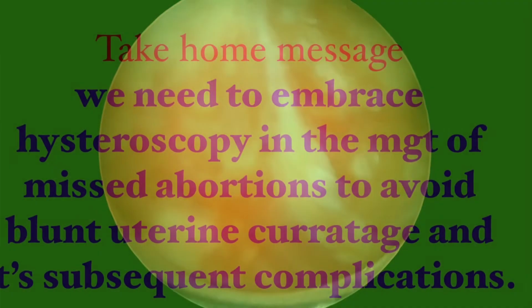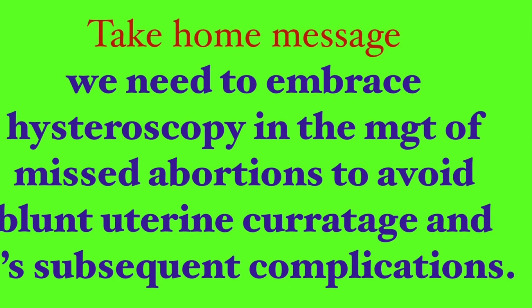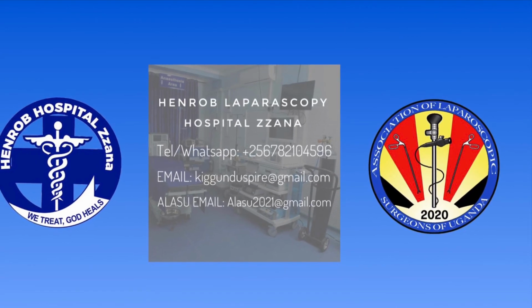What is the take home? The take home is that we need to embrace hysteroscopy in the management of missed abortions to avoid blunt uterine curettage and subsequent synechia.